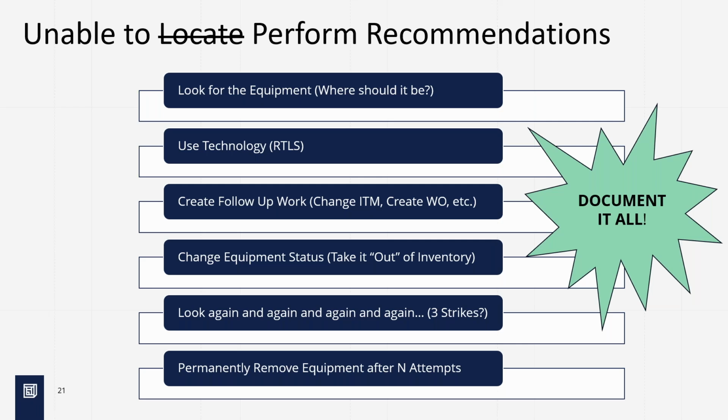I thought I saw a hand move over here. Yes. This is all familiar to me. I used to manage the database for a large medical center, 47,000 devices. I wanted to mention, we do the three strikes, usually 90 days. So every end of the month we send a notice, hey, we are not able to locate this, to cost centers and everything. And then we archive it, we change the equipment status.